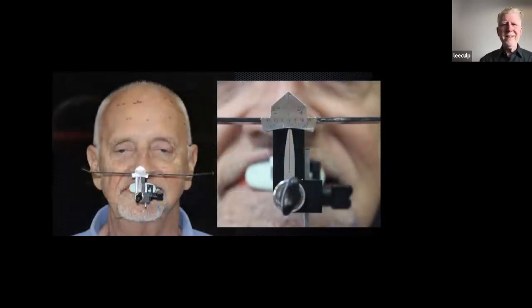Now, in the Ivoclar workflow, there is a face bow that we kind of refer to as a digital face bow. It's not, it's a physical face bow. And it just aligns things from an occlusal plane and an aesthetic plane. And there are numbers on there. Now, I have a duplicate of this face bow in my software. And then I will take your numbers off the physical face bow and apply them to the digital face bow. So we've got the same relationship to the face and the teeth that you have physically, I will have digitally.